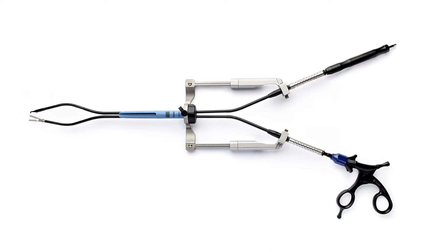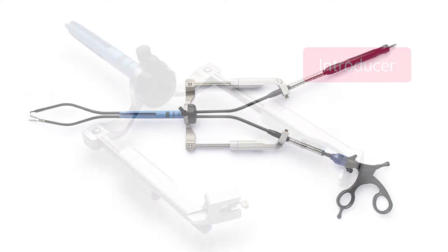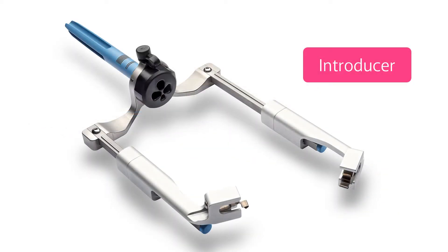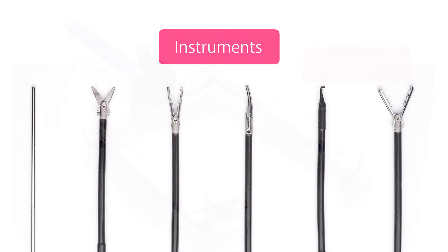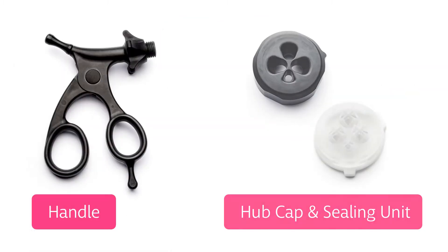The platform features several key components: an introducer, a series of six instruments, a handle, as well as a hubcap and sealing unit.